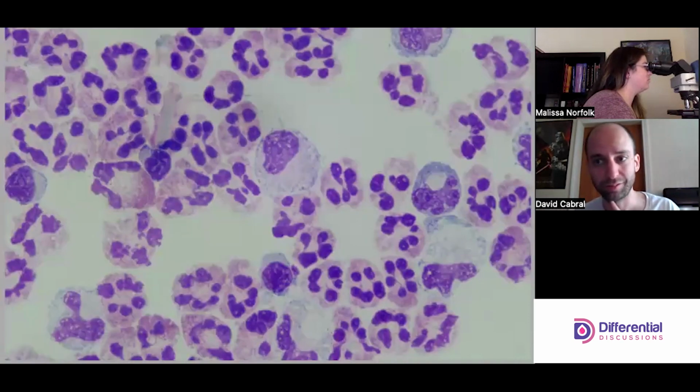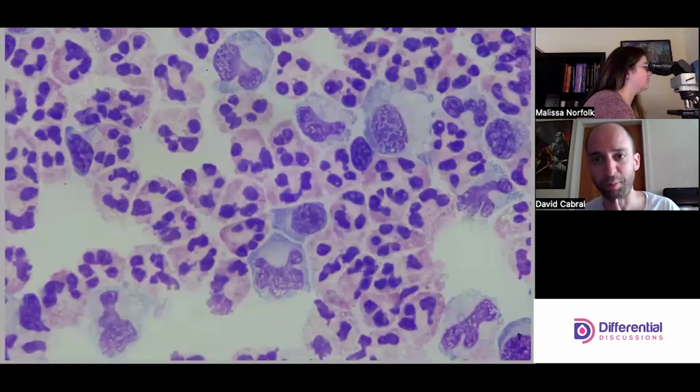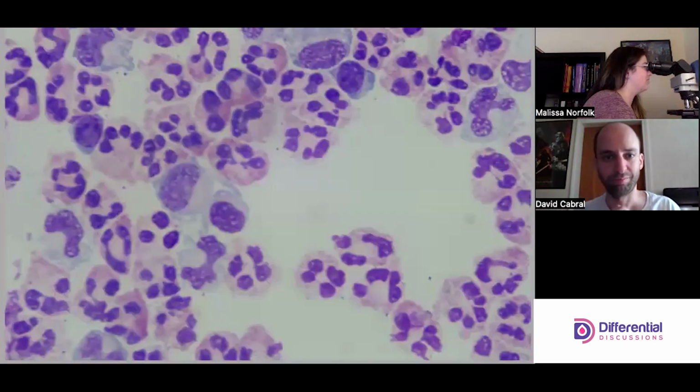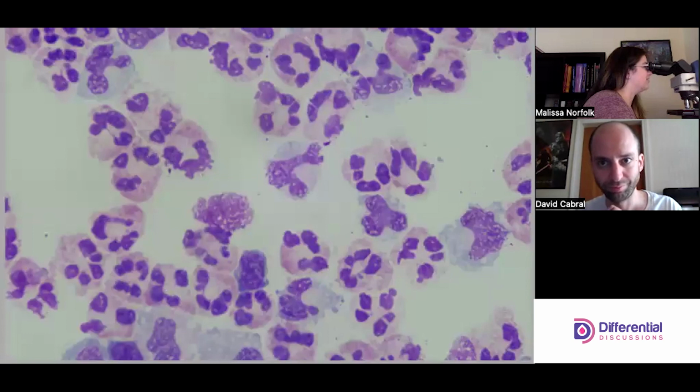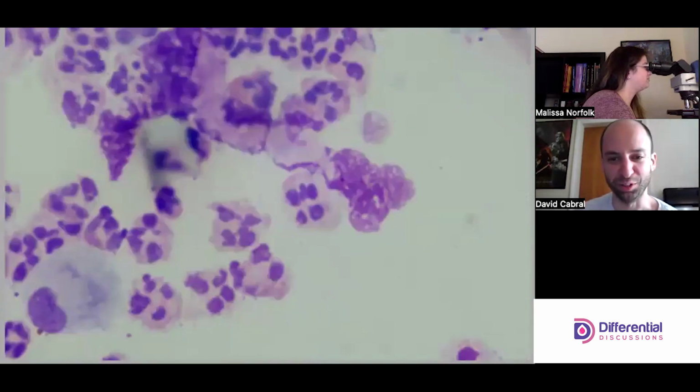Yeah, and you want to correlate the cellularity to the cell count, as best you can. So if you didn't make it and you don't write the dilution on the slide, the person's going to be like, "Why is this white cell count so high?" Yeah, exactly. Cause confusion.